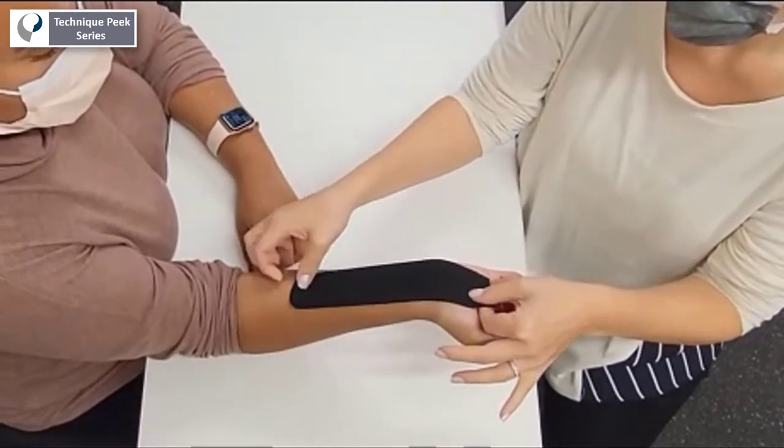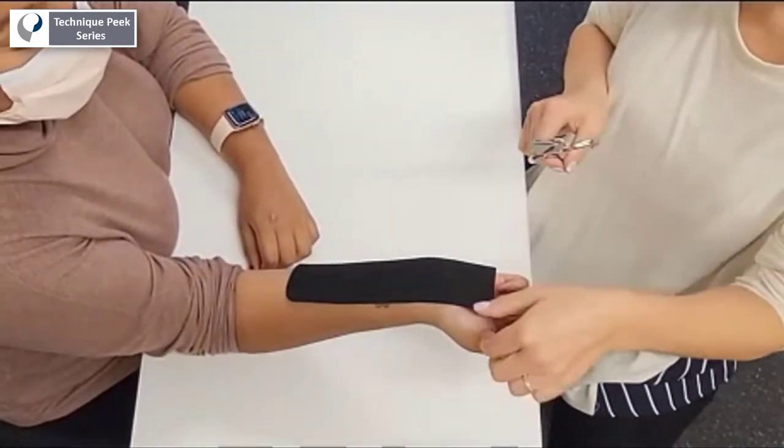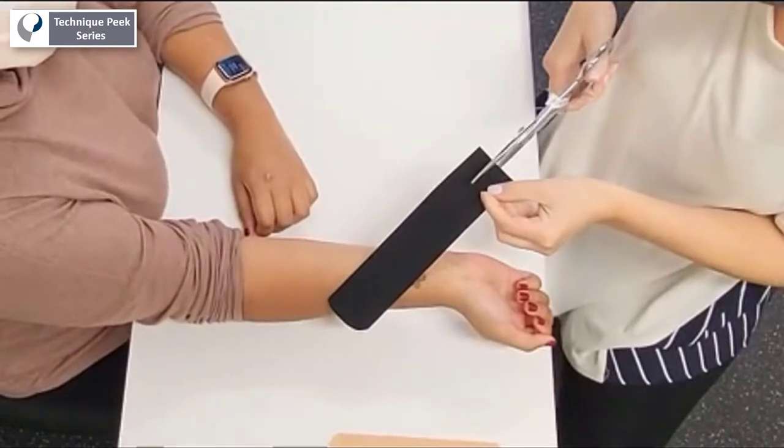Today we're going to look at a kinesio tape application for treatment of carpal tunnel. We're going to start with a strip extending from the carpal tunnel to about two thirds the length of the forearm.